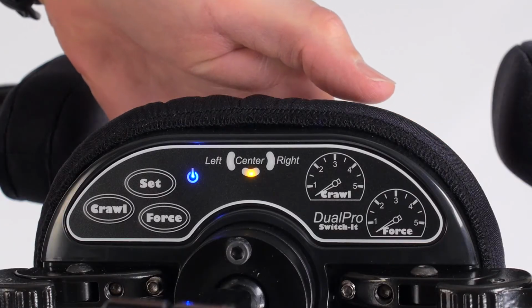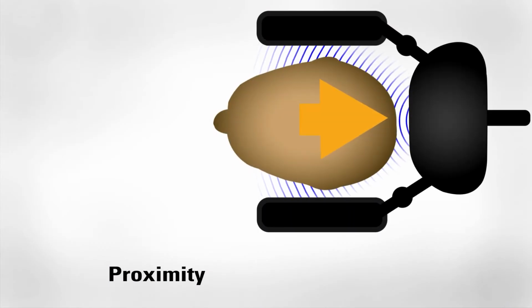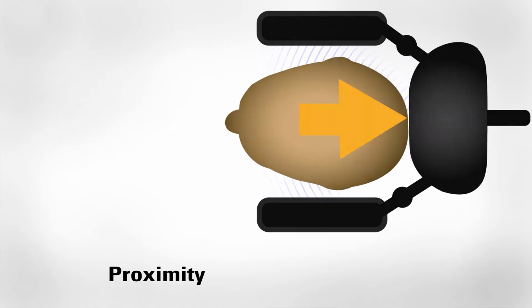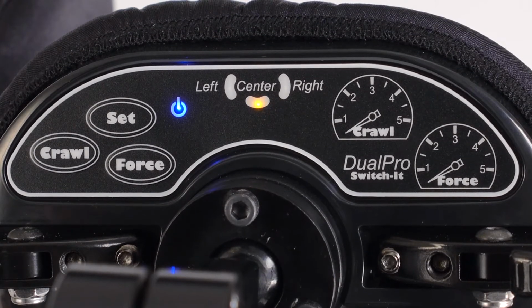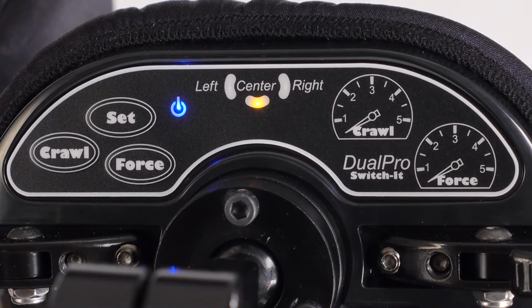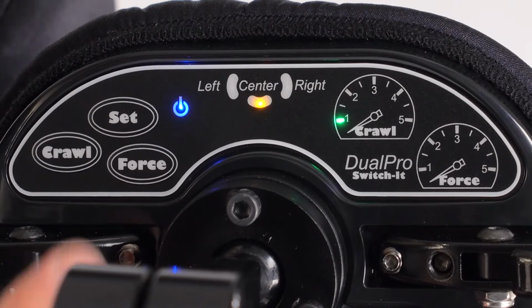Crawl senses the user's proximity to the pad. Once the user is in range, the proximity will activate at the speed percentage set on the Dual Pro. If there are no lights illuminated in the crawl indicator, the proximity sensors are disabled. Each time the crawl button is pressed, a light is added.